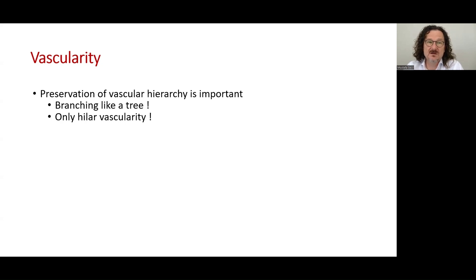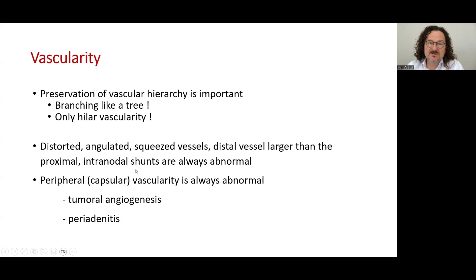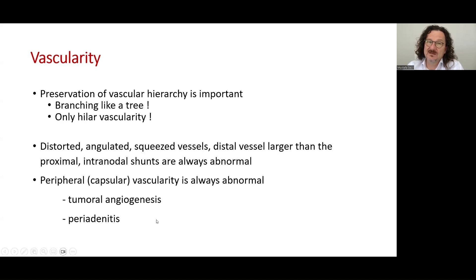Vascularity is another parameter, and preservation of vascular hierarchy is important. The vascularity branching should be like a tree, branching only from the hilum. Distorted, angulated, squeezed vessels, distal vessels larger than the proximal, and intratumoral shunts are always abnormal. Peripheral or capsular vascularity is also abnormal, which may be secondary to tumor angiogenesis or due to periadenitis.